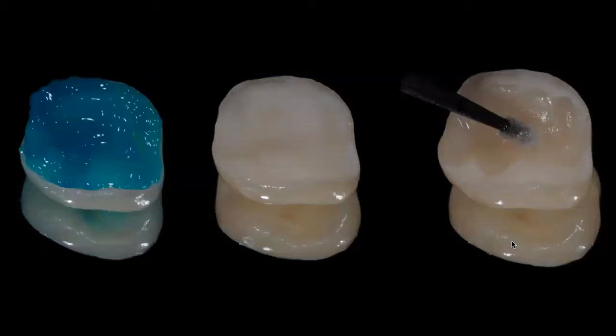So again, we really completed 6 steps. You saw from the day that we received the restoration, the trying, the hydrofluoric acid. We have now the precipitant, cleaning it with the phosphoric acid. Now you put it in the ultrasound for 5 minutes in alcohol. You remove it from there, you dry it, and you apply the silane.